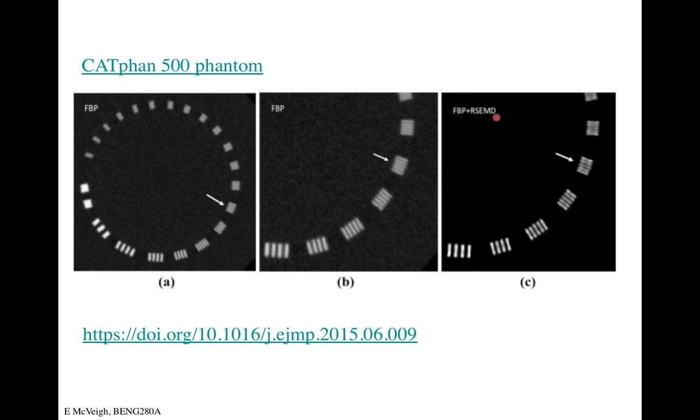Yeah? In that case, what sort of limits the radius that manufacturers set between the detector and the source of X-rays? Oh, I see. So the question, I think, is what is the limit on the dimensions of the scanner with respect to the source to detector distance, and if you can optimize it by minimizing that distance, where is the cutoff before a manufacturer says there's no point getting any closer? Right. Well, a lot of that is partially set by the mechanics: you've got to rotate this darn thing and put a patient in the middle of it, right?